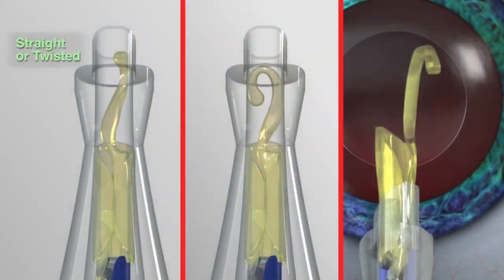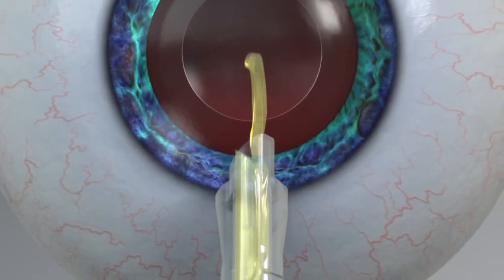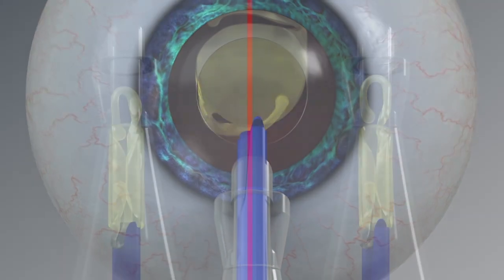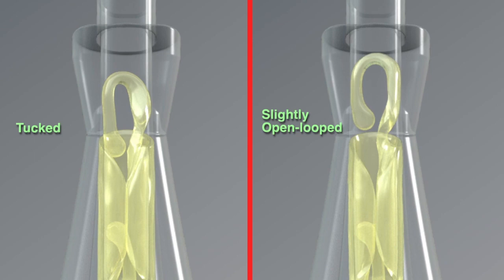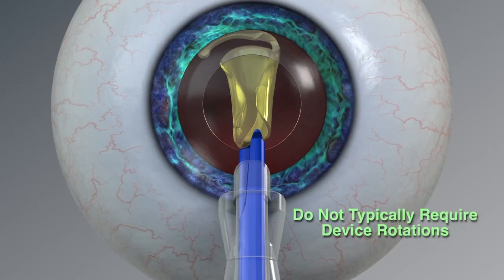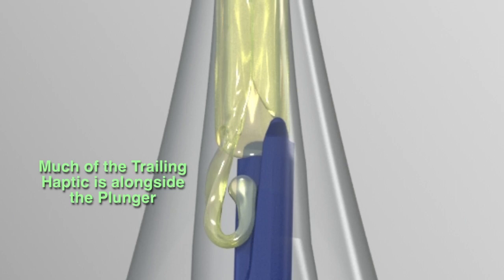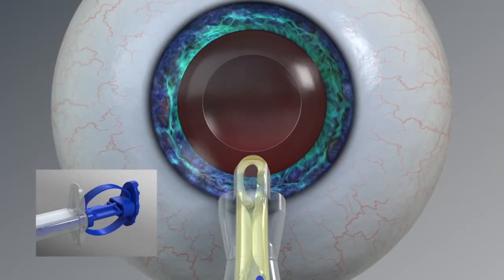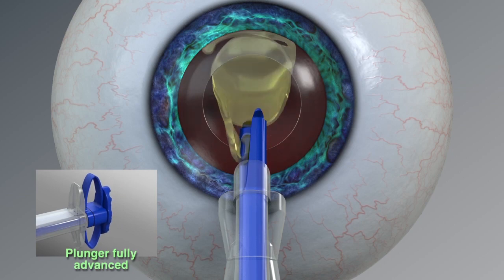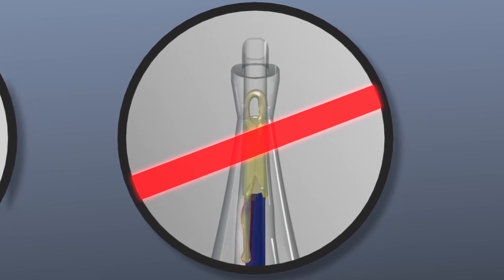This slightly open-looped leading haptic configuration should require no device rotations to place it into the capsular bag in the correct orientation. This configuration also shows a fully tucked trailing haptic with minimal trailing haptic alongside the plunger, which should not typically require fully advancing the plunger. In summary, straight, twisted, open-looped, or S-shaped leading haptic configurations are normal and the IOL can be delivered by rotating the device as previously described. Tucked and slightly open-looped leading haptics are normal configurations that do not typically require device rotations. This straight trailing haptic configuration cannot be delivered — do not proceed with this lens implantation. In this rare case, contact your Alcon representative.